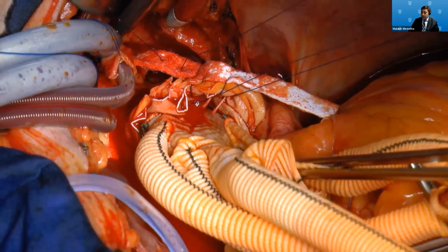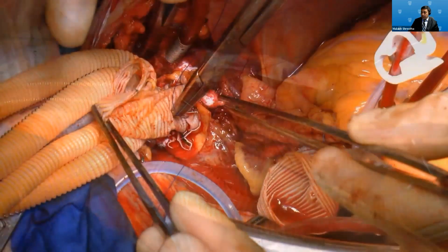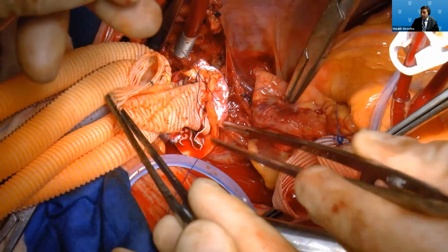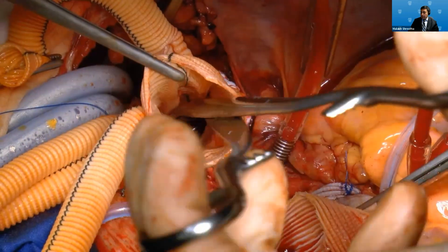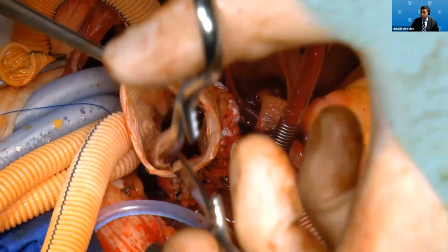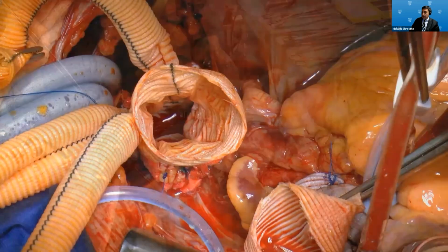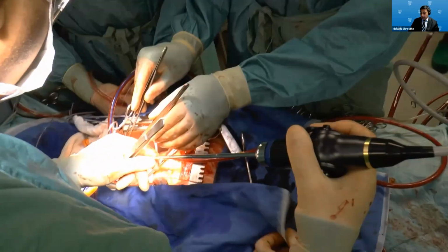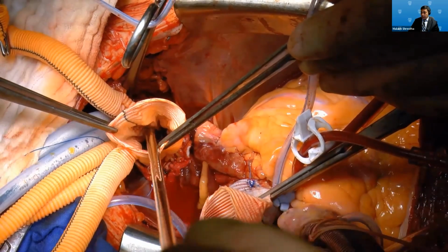In acute dissections, we do use the Teflon, because the most important thing is that there should be no bleeding at the end. And when we designed this graft, actually, like Dr. Arminder says, we made the collar very small. To open up the graft, I do use these forceps, and most importantly, I'm always using an endoscope pre-deployment and post-deployment so that one knows exactly how it looks.